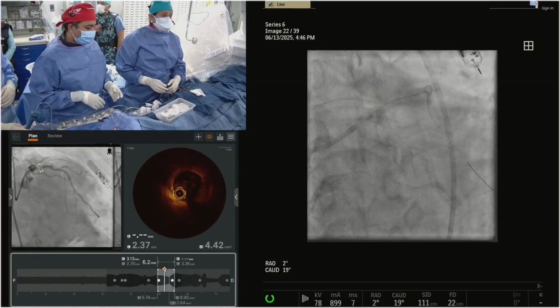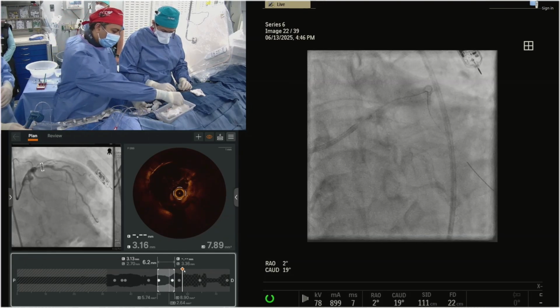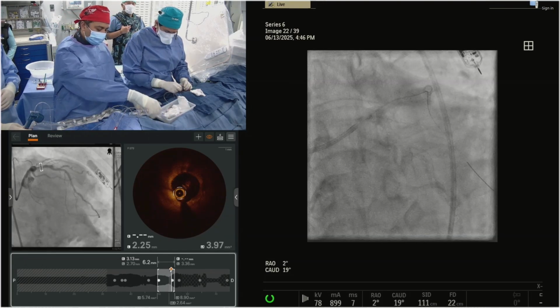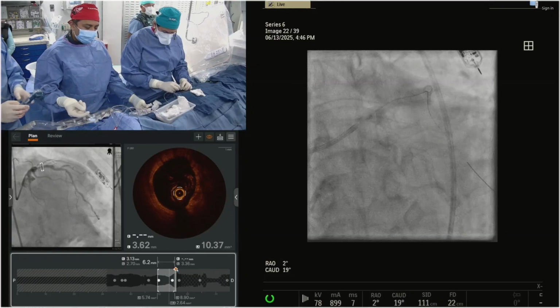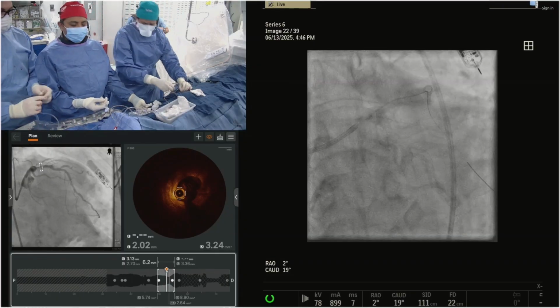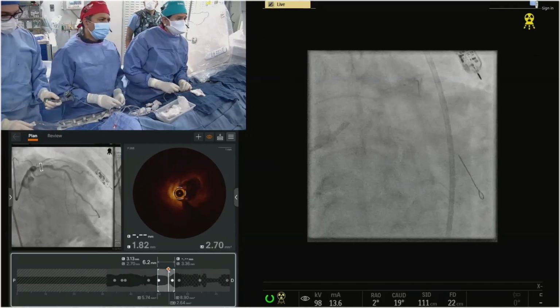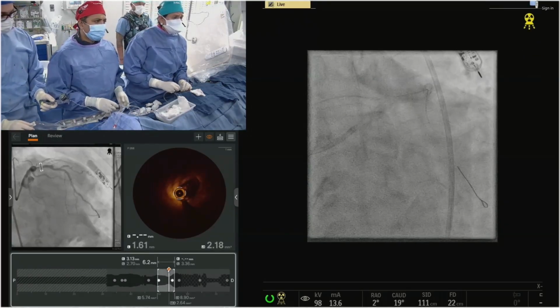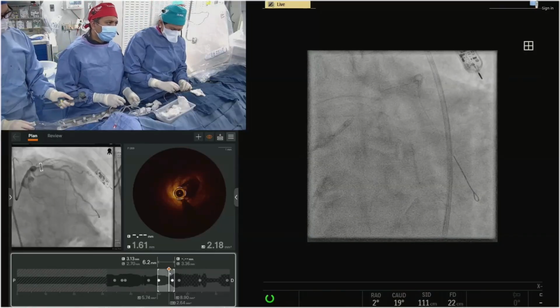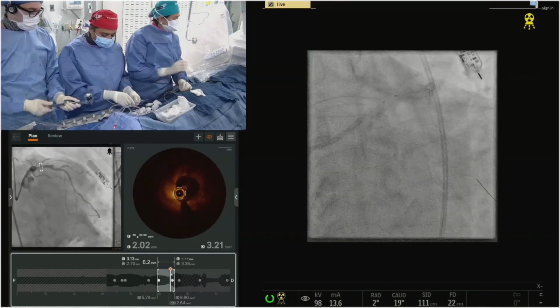First, it's a very tight stenosis, so the blood clearance is not perfect. And I see some small calcium distal to that lesion. Did you do this pullback on manifold or automatic injection? We did assist. Earlier in the case we did it by hand. Okay, I think it's right there, right?